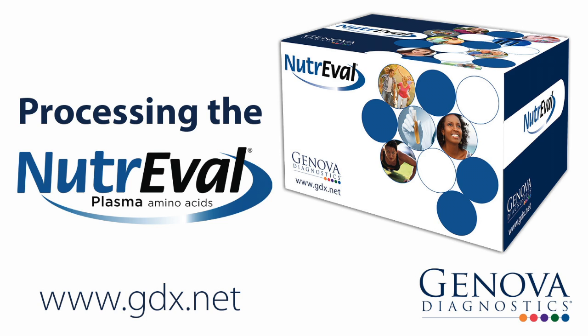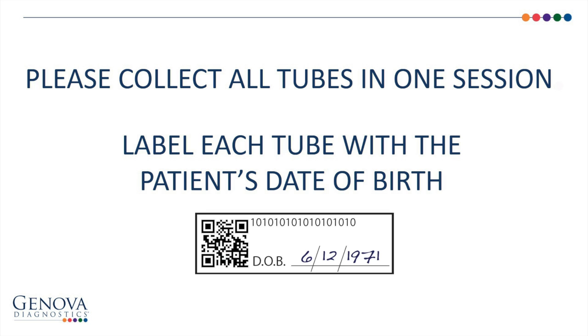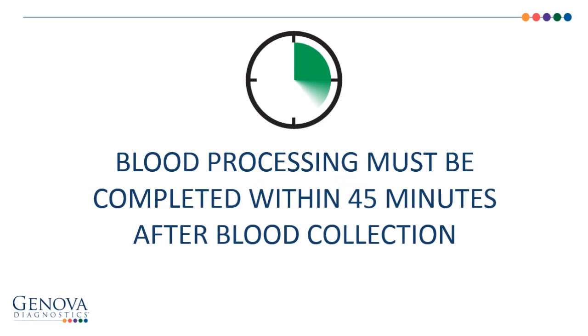How to Collect and Process Samples for the NeutraVal Plasma Test. Please collect all of the tubes in one session and label each tube with the patient's date of birth. Please note that all blood processing steps must be completed within 45 minutes after the blood collection.